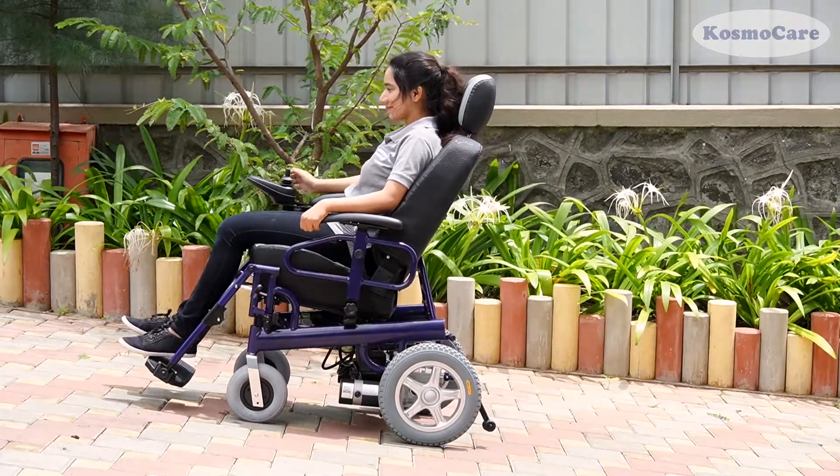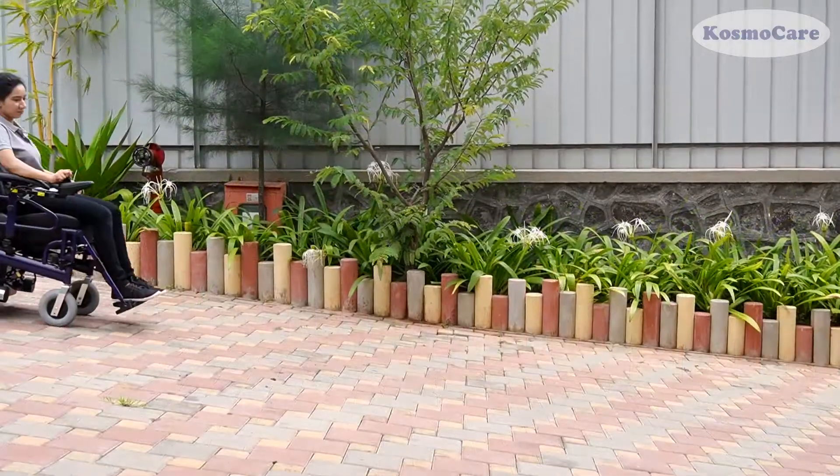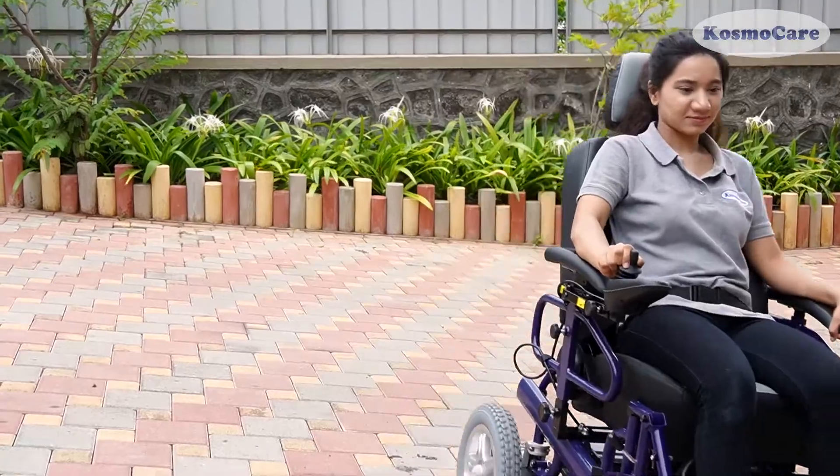Electromagnetic brakes allow you to easily ride and stop in the middle of a slope. Give your loved ones the convenience they deserve with a Rider Power Wheelchair from CosmoCare.